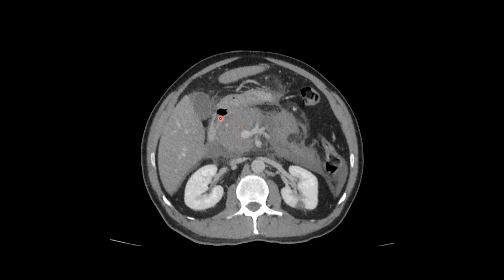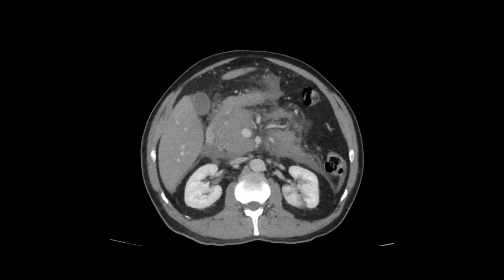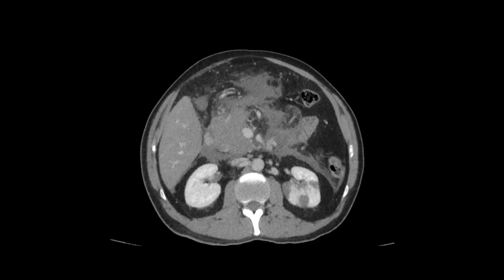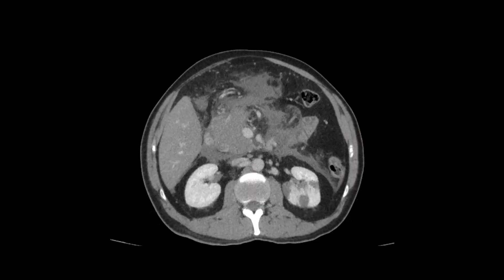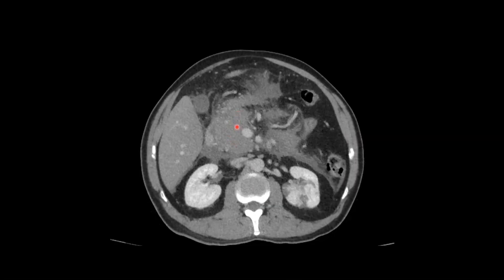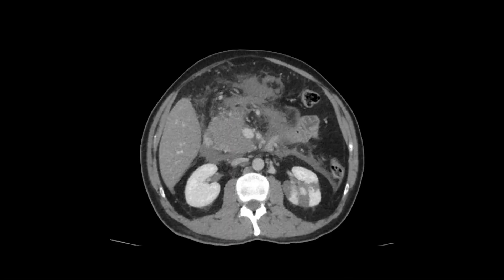Here we can see the gastroduodenal artery in the pancreatic head — that looks normal. Scrolling inferiorly, you can get a sense that there's some more normal pancreatic parenchyma in the pancreatic head. Notice how that's enhancing normally compared to the hypoenhancing or non-enhancing area more superiorly in the pancreatic head.